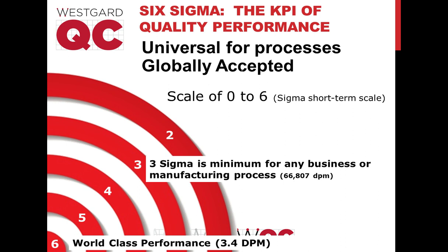All right, so what we would probably want to do in this case is use multiple samples over multiple months to determine the bias. We wouldn't want to peg too much importance on just the one single once-per-month measurement. If we would calculate something like a confidence interval around that, we would not be very happy.